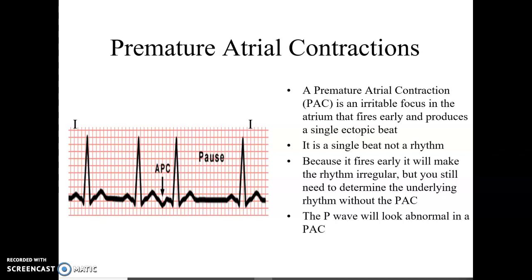Looking at this rhythm here, I can see that from P to P looks normal, and then this beat came early. The spacing from this beat to this beat is early, and then you can see it lengthens out — so this is going to make this an irregular rhythm. My rate in three seconds, it looks like I have one, two, three, four — so my rate would be 80.